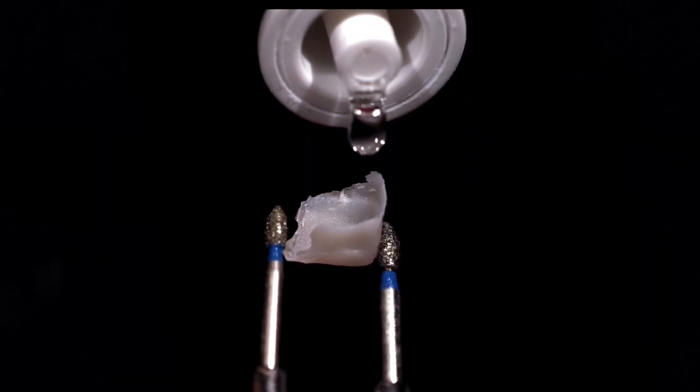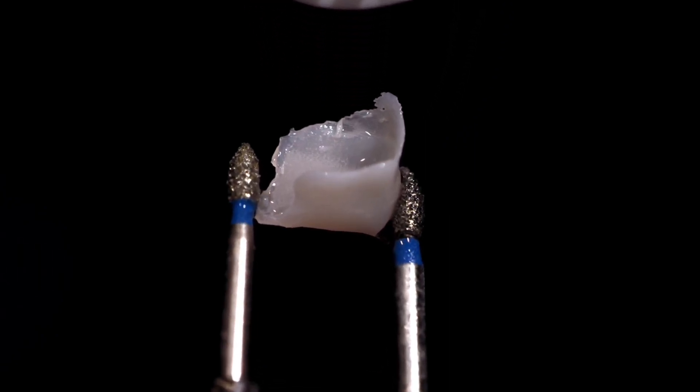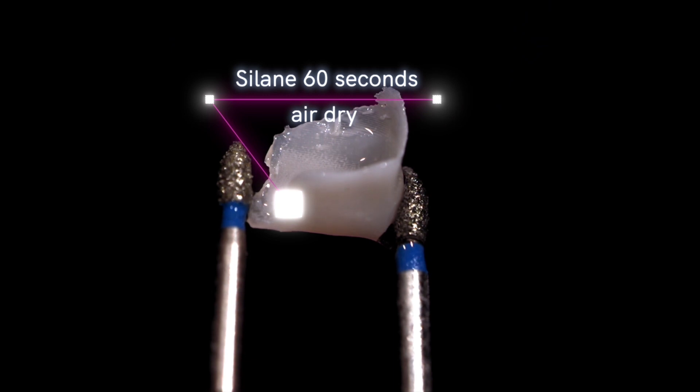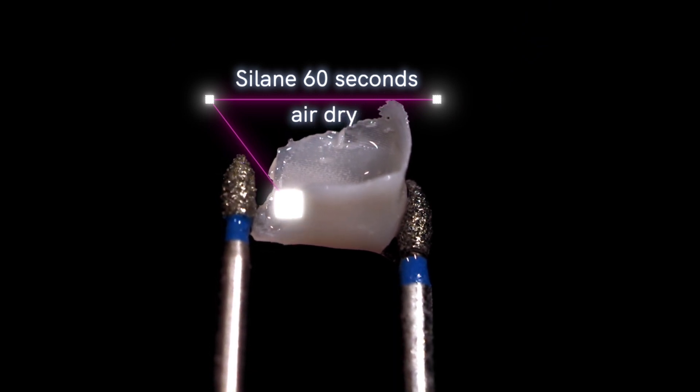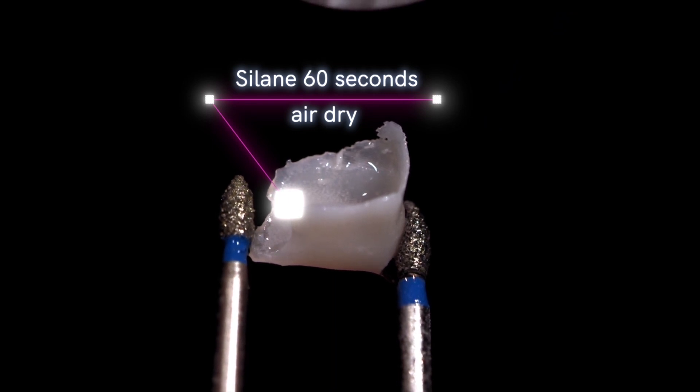After you get that rinsed off and dried, you're going to drop some silane in there. My favorite silane is Monobond Plus by Ivoclar. This is an organic to inorganic coupling agent. Remember, these printed materials have a bunch of glass filler particles in there, and this is going to help them adhere to your resin cement.